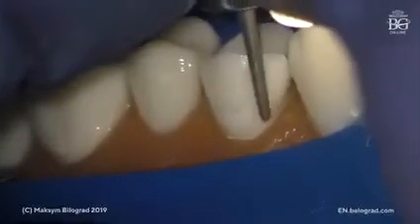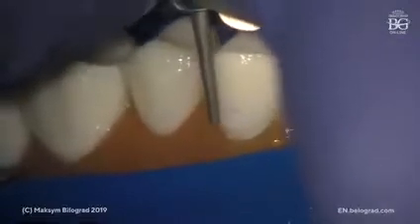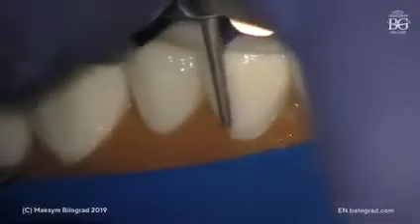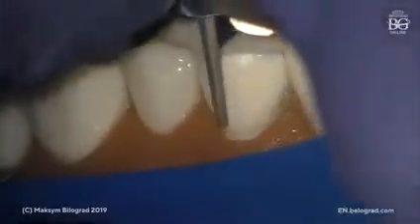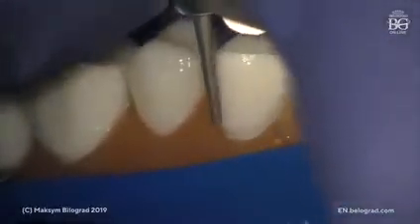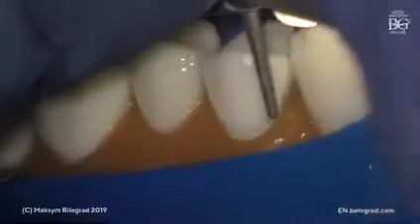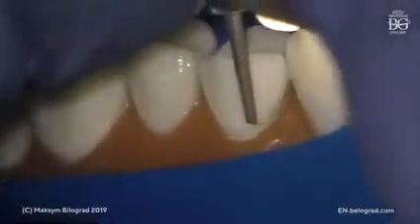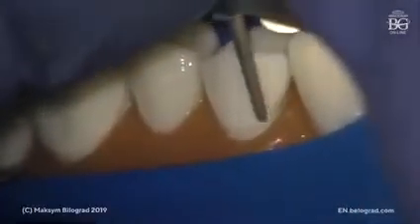What is really important during this step is not to make the finish line at the very beginning, because if you concentrate your energy and your attention on the finish line, you will make an undercut. We have to concentrate our energy and attention on prepping the bulbosity, removing this mark, and you will get the finish line automatically because of the design of the burr.